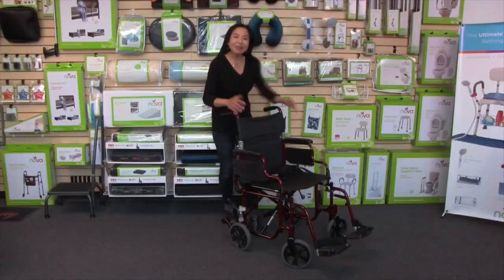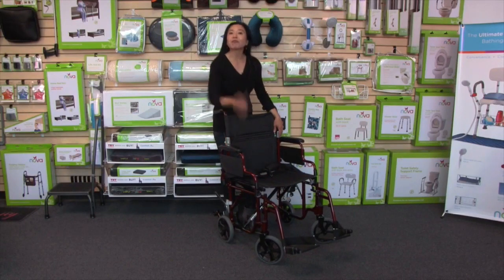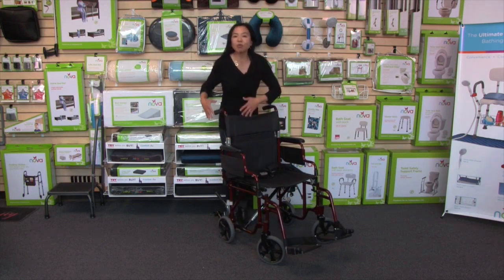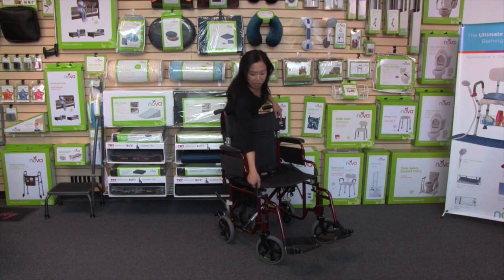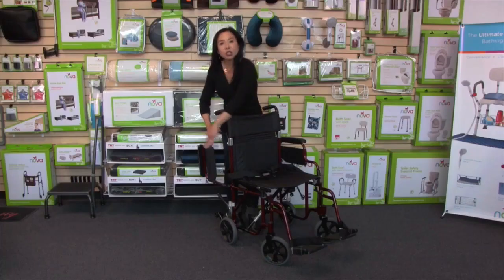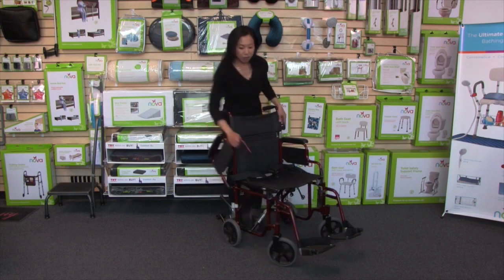The feature I love about this transport chair is that it has desk arms that are flip-up and removable. These arms are designed to allow you to roll the transport chair and the user up to a dining table or a desk. They can also very easily flip up with the push of this button, making it so much easier to transfer the user in and out of the transport chair.